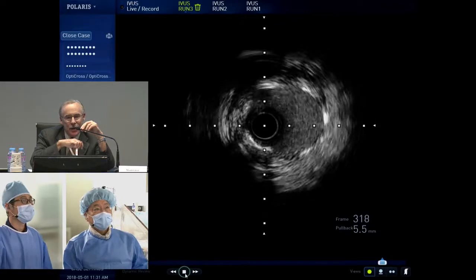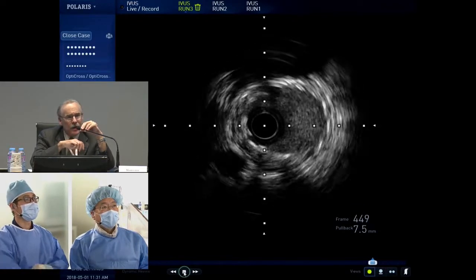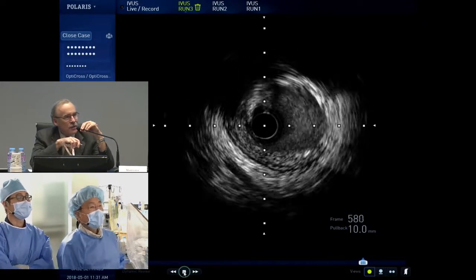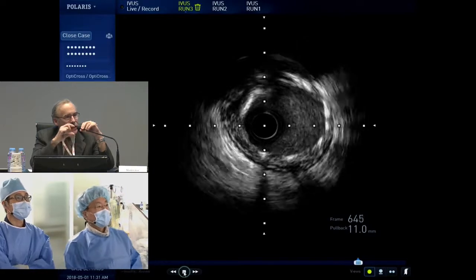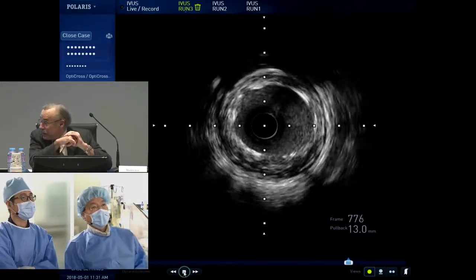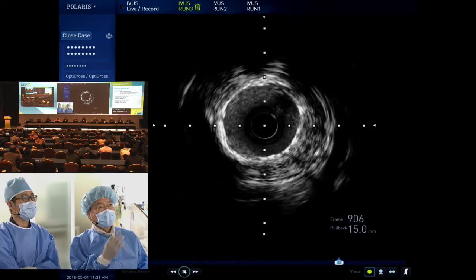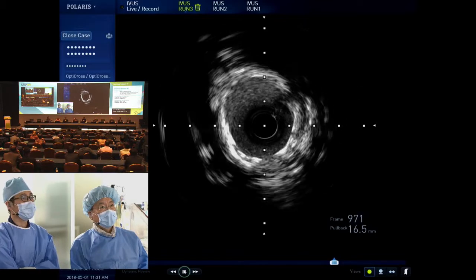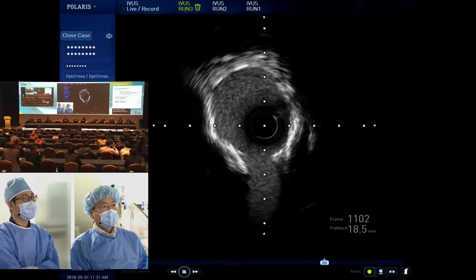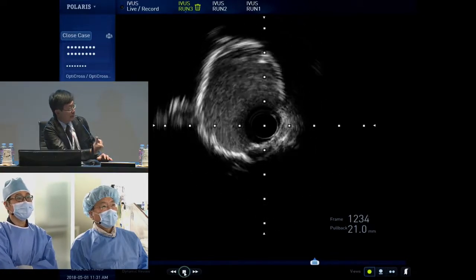No, I understand that. I understand exactly why you didn't use rotational atherectomy, but orbital atherectomy would have been an option, although I'm not sure its role is all that well defined. I was asking your opinion about orbital atherectomy for a large calcified vessel. The orbital is not available here in Asia yet. So with conventional rotational, we just cannot pick up the big size. So for orbital, maybe Steve can share some experience. That's in the future. Maybe this one would be a good case.